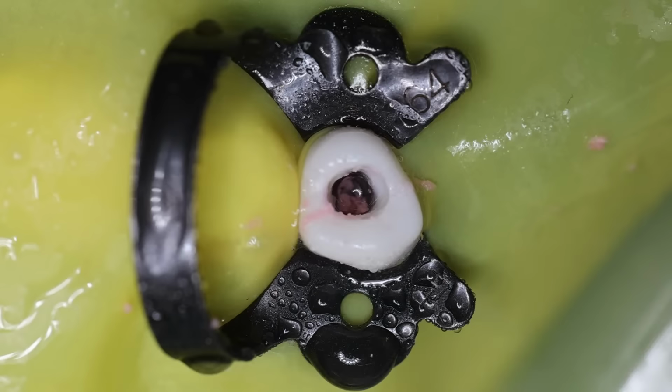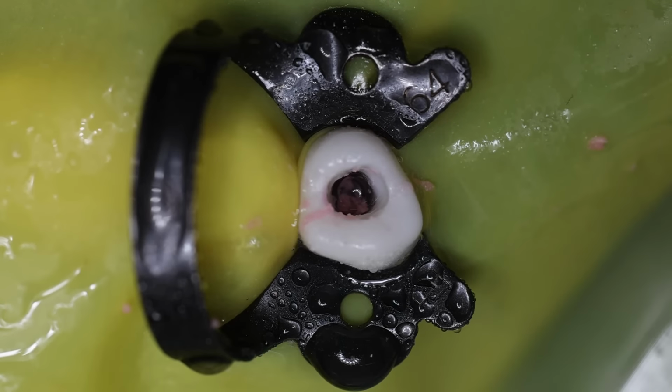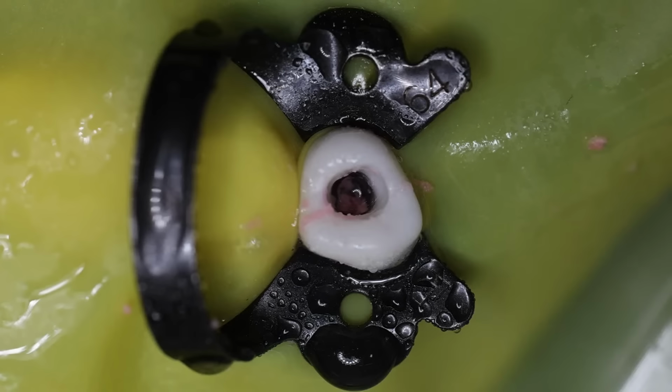The other best alternative is that you can switch to the endo Z bur. Okay, so you can start using the endo Z bur that we have as an option, and that will help you out. So I am just switching to that.